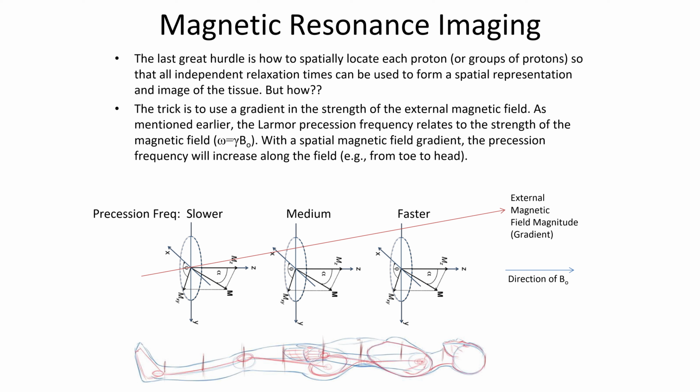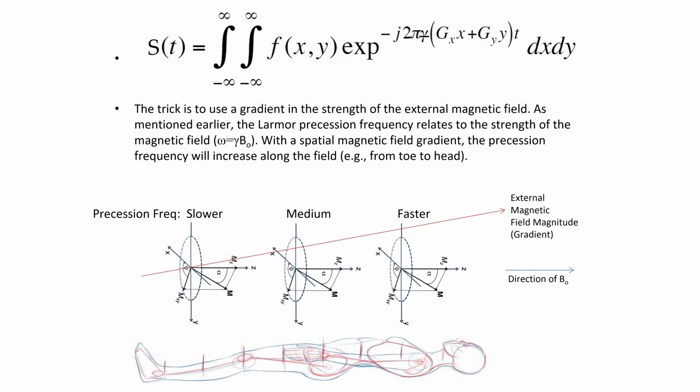You remember when we talked about EEG, we talked about taking a time signal and doing a Fourier transform to convert it into its frequency domain and see all the frequency peaks. Well, here we're kind of doing the inverse. We're taking all the frequency peaks and doing a Fourier transform, but not back to a time domain. We're just going to change the name of the variable. We're going to do it to a spatial domain. So the equation for the Fourier transform is shown here at the top.